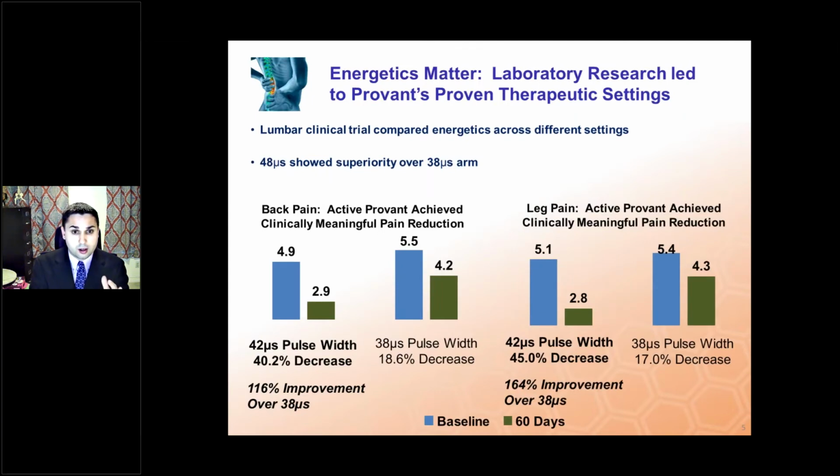We'll talk about this type of slide later on, but I'm giving you an example so that it drives home that the settings will matter. There was one study comparing people with back pain and leg pain from post-laminectomy type syndrome or failed back syndrome. If you change the pulse width, as this study showed, you could see there's a difference in clinical outcome.